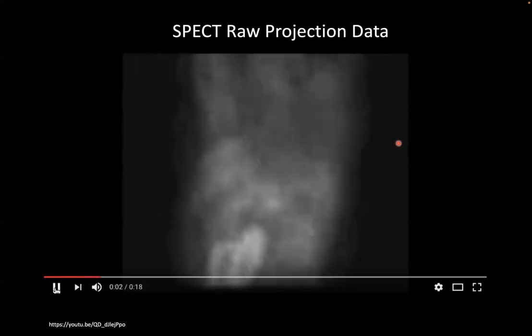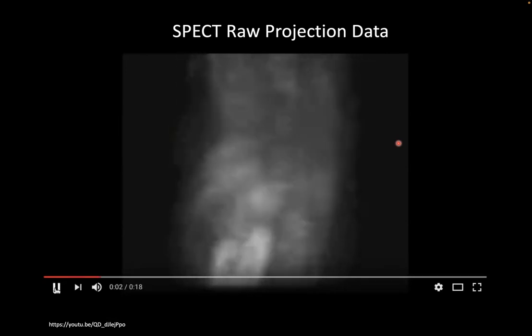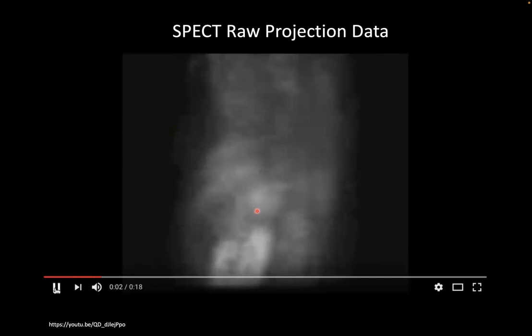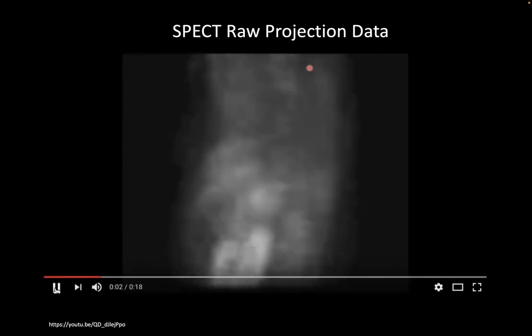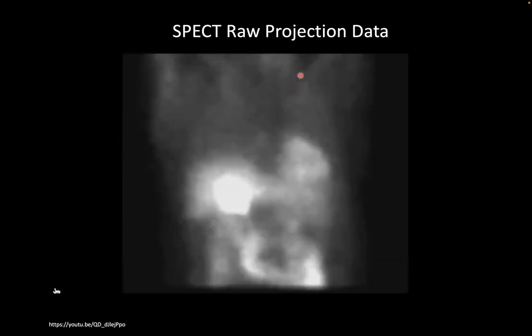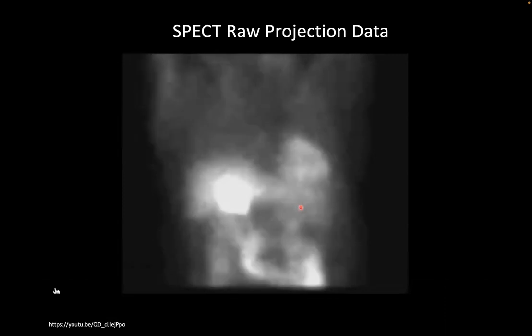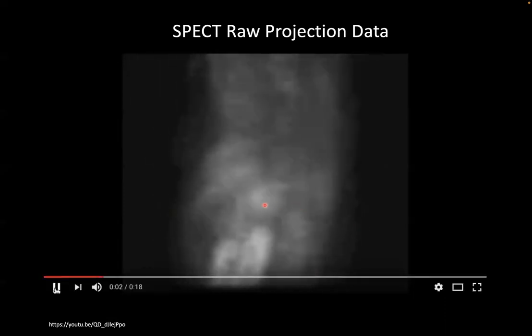This is what it looks like when we look at those two examples I gave you, the pictures of the scanners. Here you have a fairly long detector in the Z direction. This is the patient's head. That's their neck, and they have their arms above their head, so they don't get their arms in the way of your imaging.